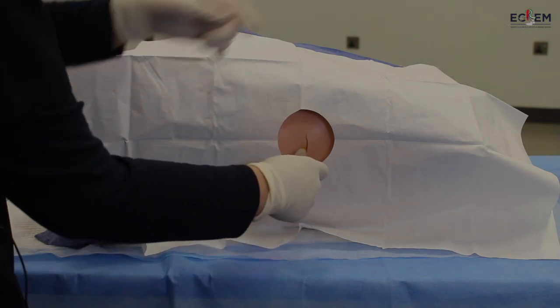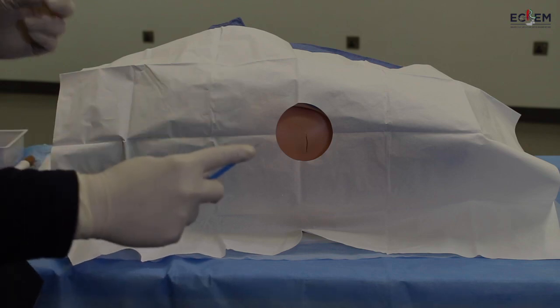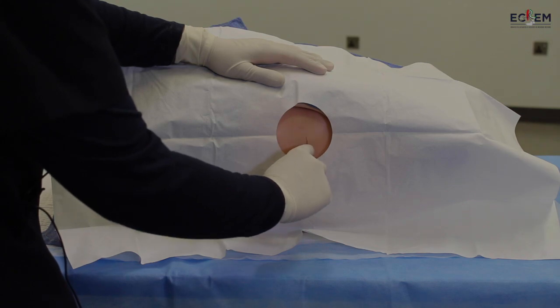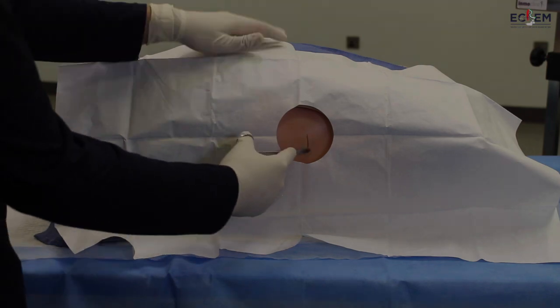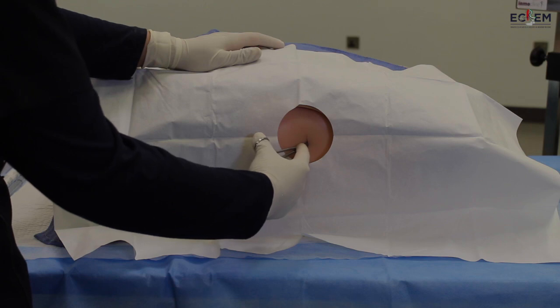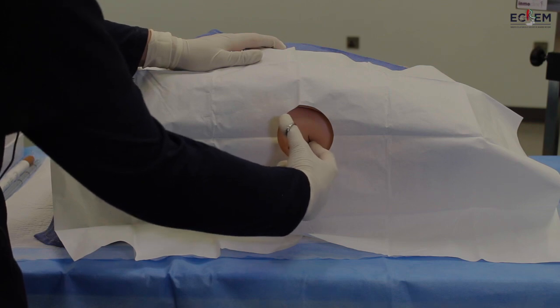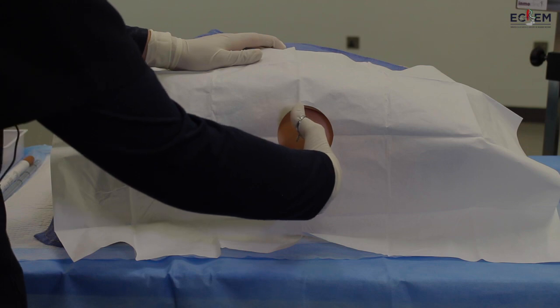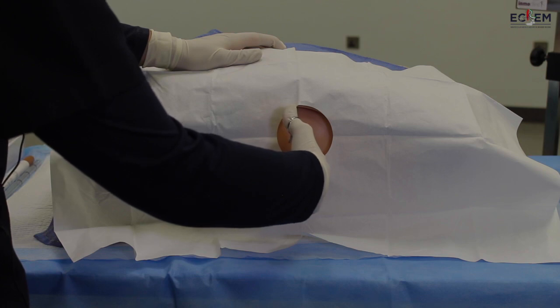With a scalpel — held here to stabilize — we make a two to three centimeter cut in our safe triangle. Then with a Kelly clamp, bluntly dissect through the incision, through the subcutaneous tissue, over the upper margin of the rib until a rush of air or fluid occurs. Once this happens, open the clamp and while still inside the pleural space withdraw with the clamp still open to enlarge the dissected tract.